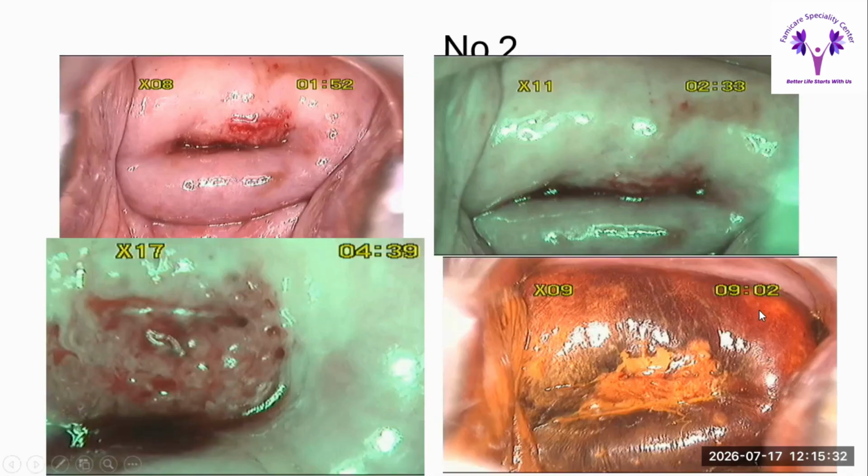And now here we have applied the Lugol's iodine. What I wanted to show you is that this area is mahogany brown, and this area is not. It hasn't taken the iodine as it should have. I'm not showing the acetic acid image again right now; I wanted to show you the Lugol's iodine. So one should take the biopsy from here as per the newer guidelines.